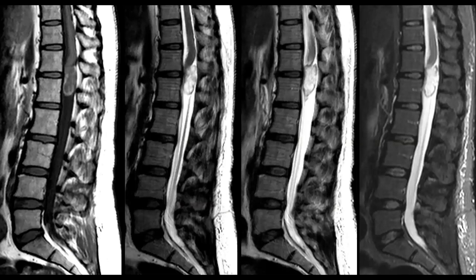There is an intrathecal, intraspinal, extramedullary, heterogeneously enhancing mass at the level of the conus medullaris. And I would say that the differential diagnosis would include a myxopapillary ependymoma, a schwannoma, a clear cell meningioma, a drop met, and much less likely a paraganglioma, in that order.